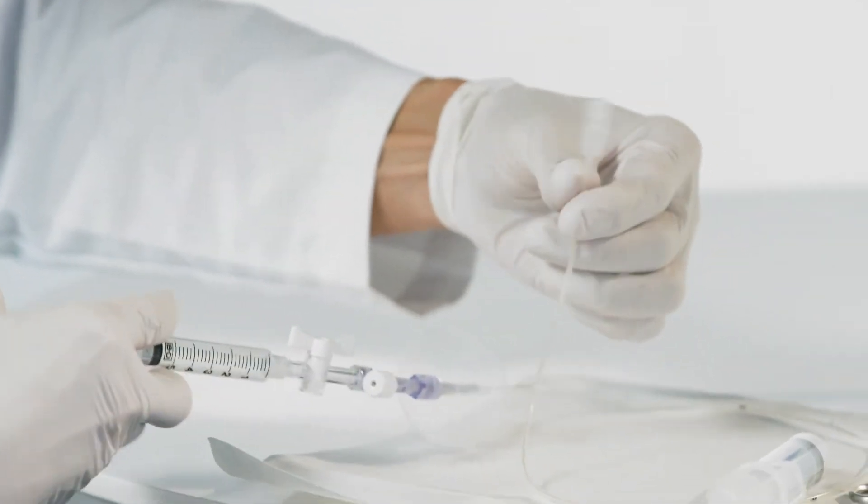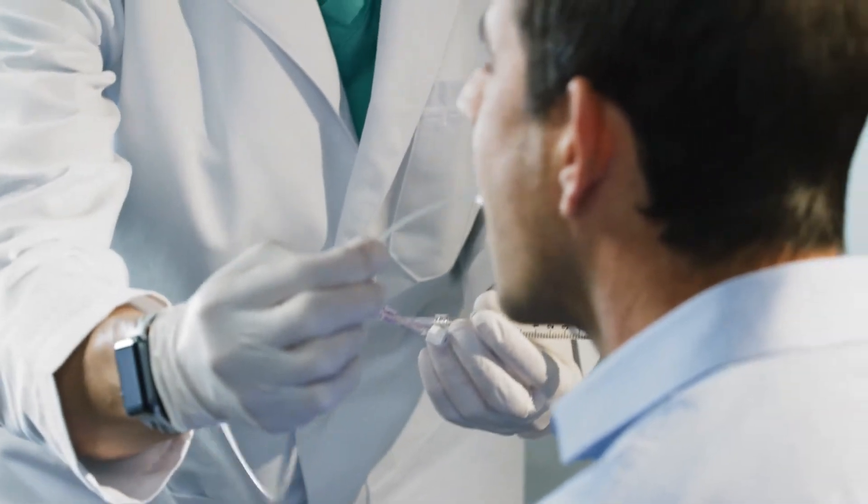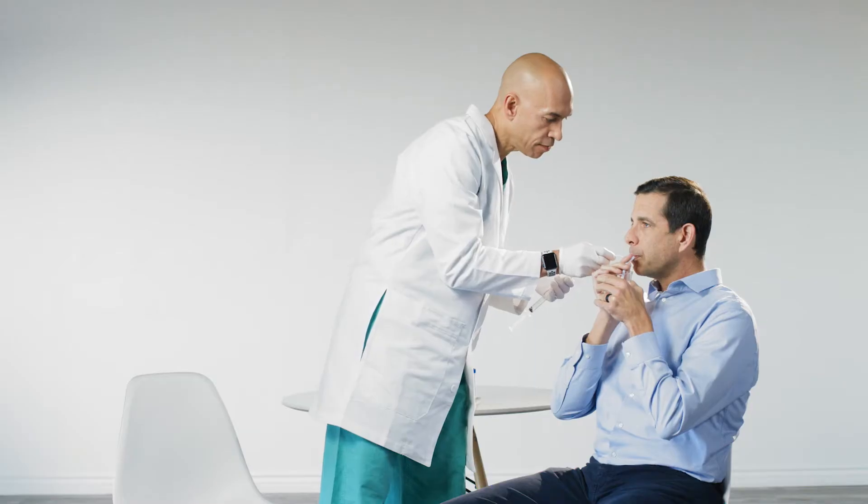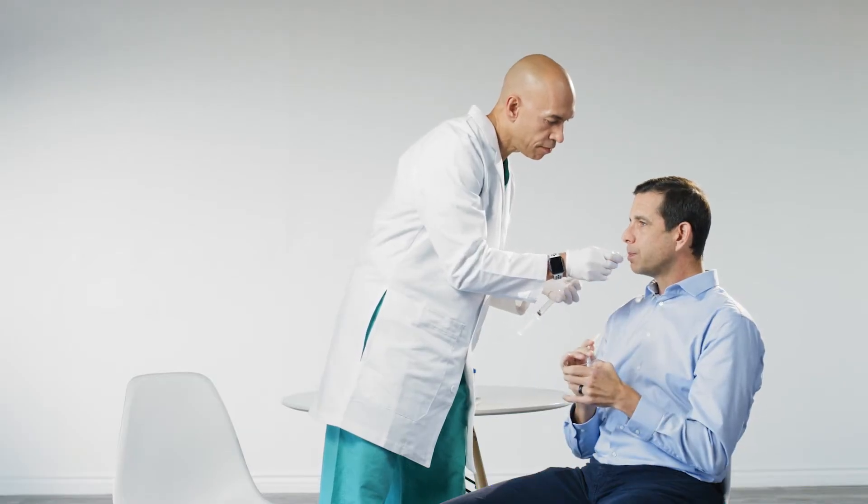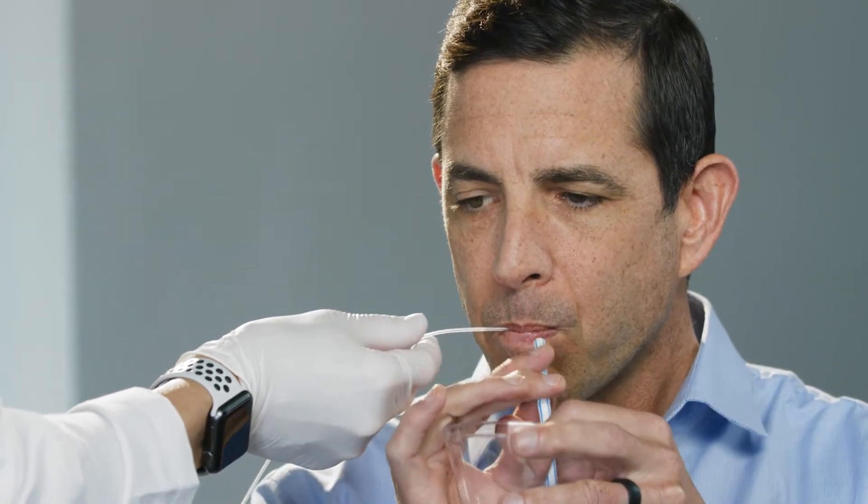Your doctor will begin by placing the small gel capsule-sized ESOCheck capsule at the back of your mouth to be swallowed. Sips of water can help advance the capsule more easily, and your throat muscles will aid in the movement of the capsule to your stomach.